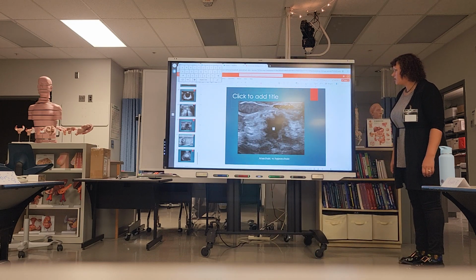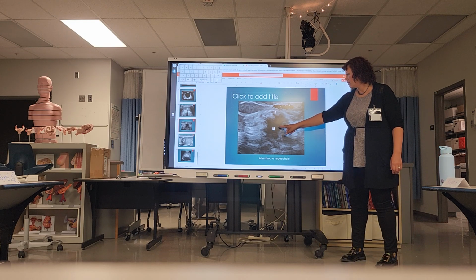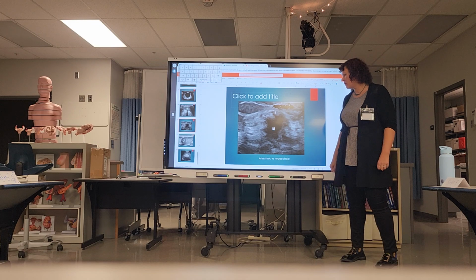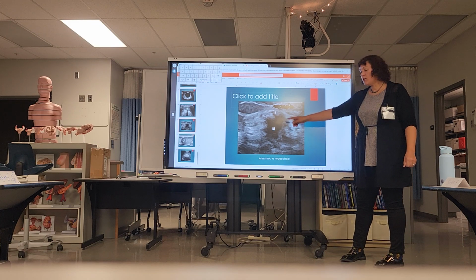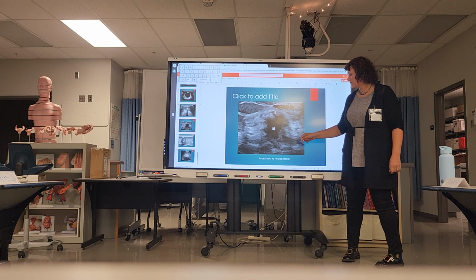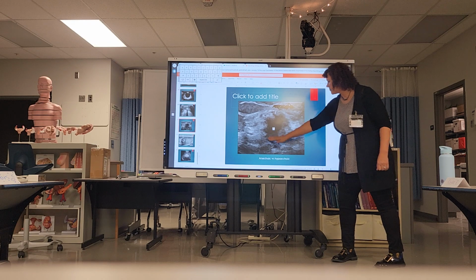Okay, so now we have another breast mass. How would you define the echogenicity here? Hypoechoic, exactly. Why is this not anechoic? It's solid, yeah. How do we know that it's solid? No fluid, no enhancement. There's no enhancement. That's your clue.